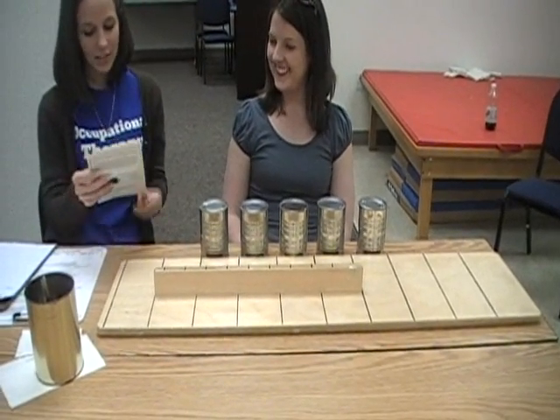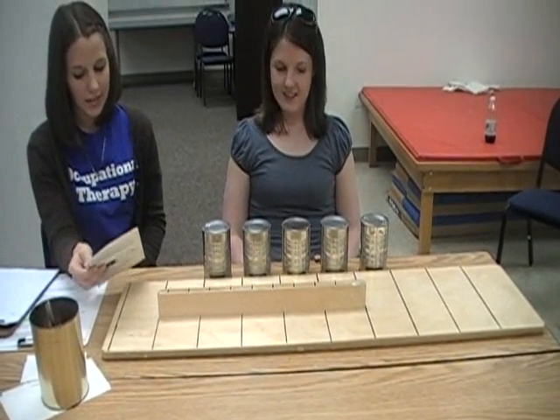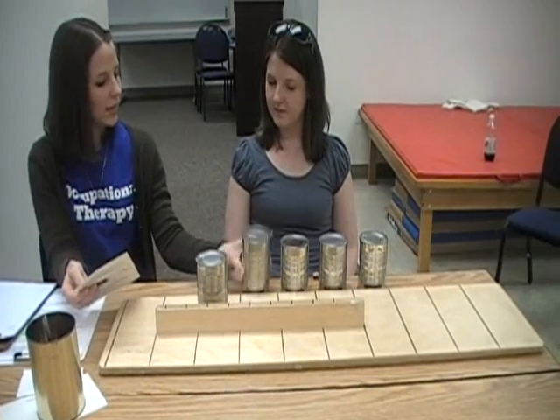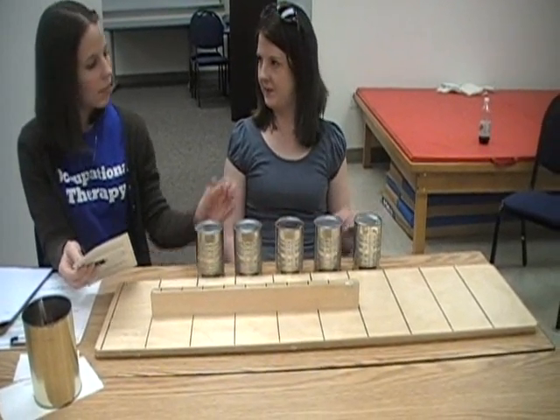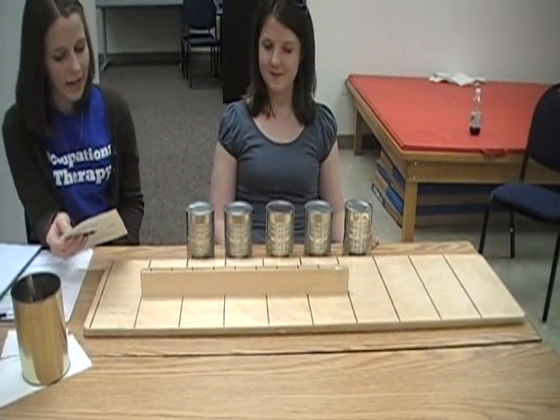Place your left hand on the table please. When I say go, use your left hand to stand these cans on the board in front of you like this. Begin with this one. Do you understand? Ready? Go.